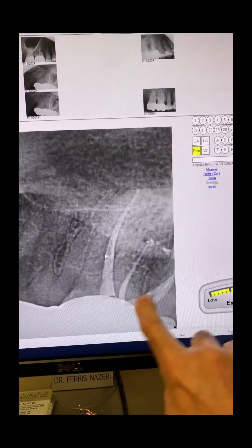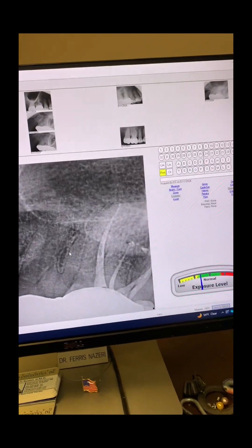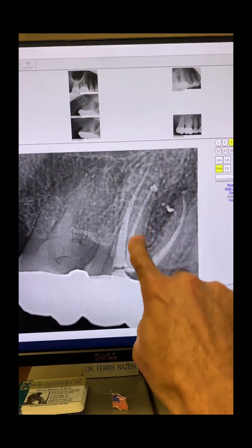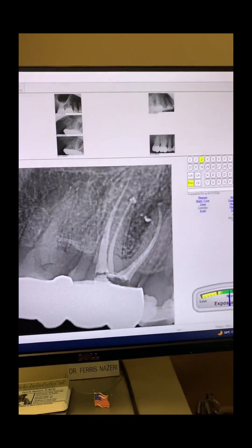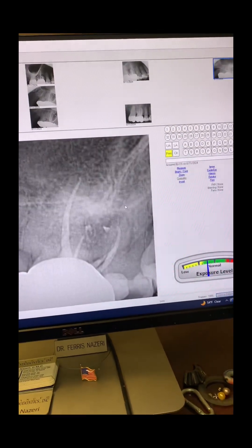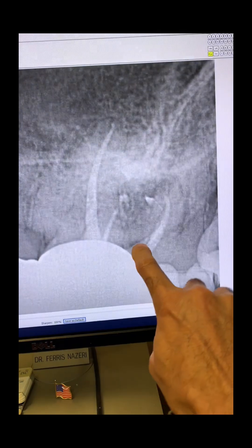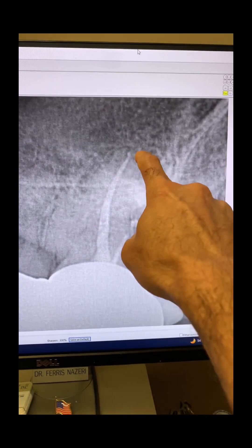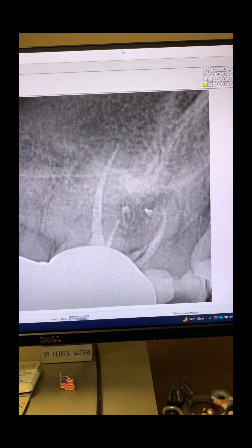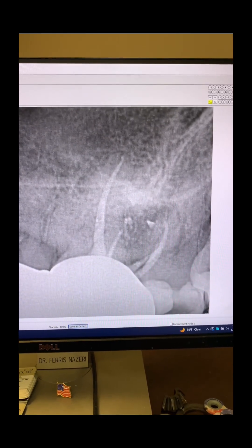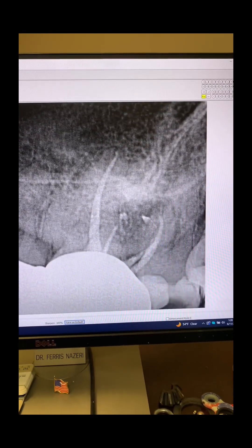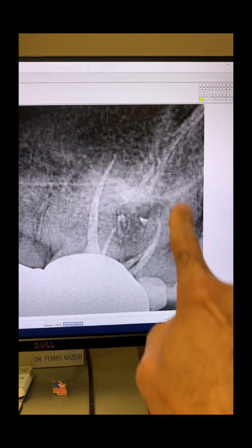You can see it again here — the MB2 that the endodontist had missed. In this angulation you can see the MB1, MB2, the distal column, and the palatal, with a beautiful lateral right into the lesion. We were able to capture that beautiful anatomy throughout. Everything went great — we went ahead and temporized the tooth and referred the patient back to her dentist for the permanent restoration.